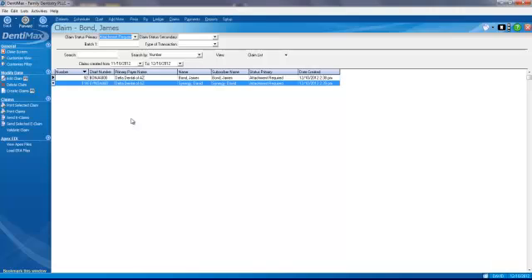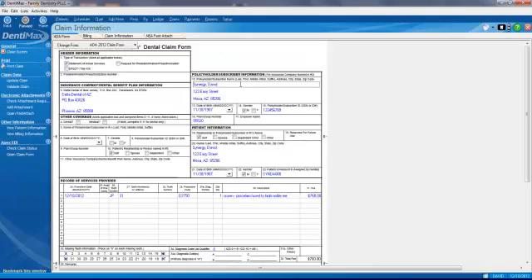We're going to see right here for David Synergy that he has an attachment required for his claims. So we're going to double click on his claim here.